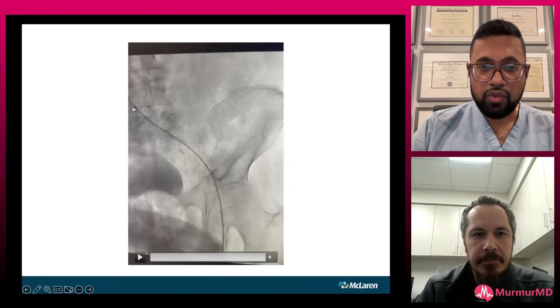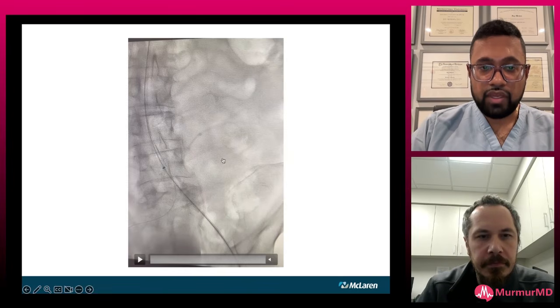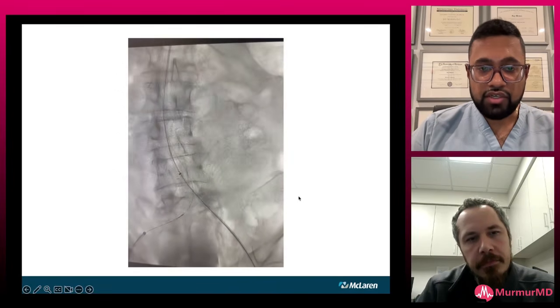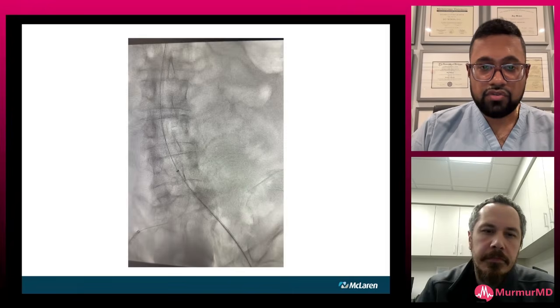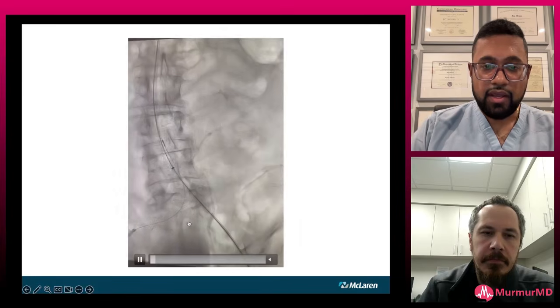went up with our sheath in through the CTO on the left leg, and now we have bilateral sheaths in going across the lesion. And just like you mentioned, the next thing I do is IVUS. So I sent the IVUS up. Typically, I'll use an 018 IVUS or an 014 IVUS. I think in the iliacs, the 018 has a nice role because of the field of view. Sometimes the iliacs are too big to see.